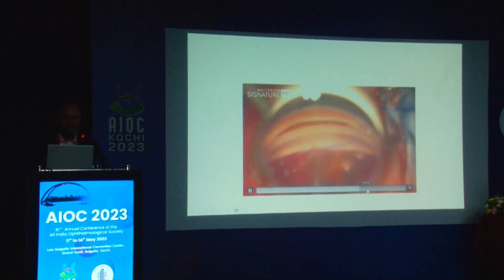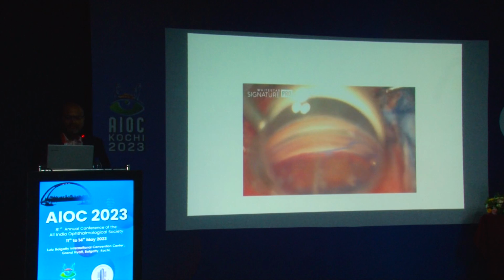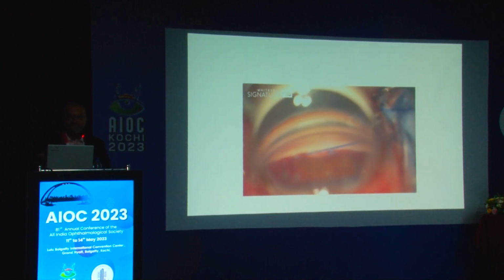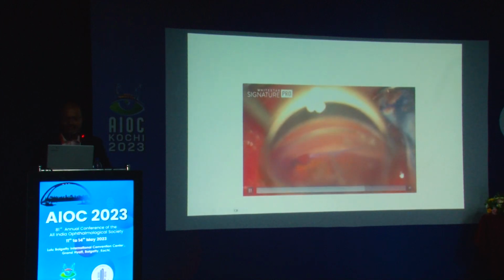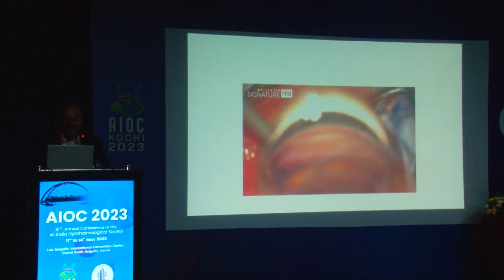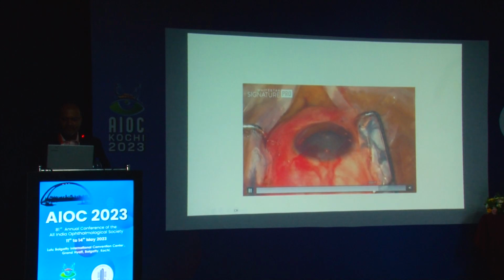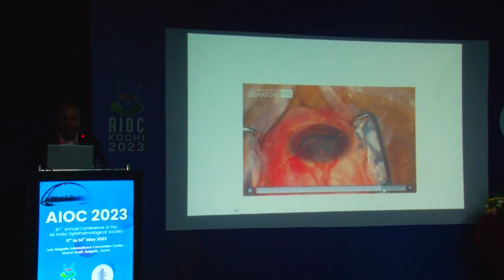And you will have to come out, put viscoelastic, go back in, do the procedure, come out again, put viscoelastic. That has to happen constantly. Sometimes the bleeding is so much it covers the interface between the lens and the cornea. So that also we have to keep cleaning the lens at the bottom. And then once you are through, you pull the suture and do the trabeculotomy.